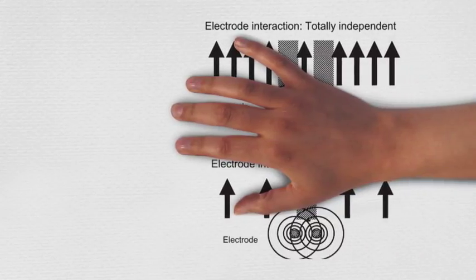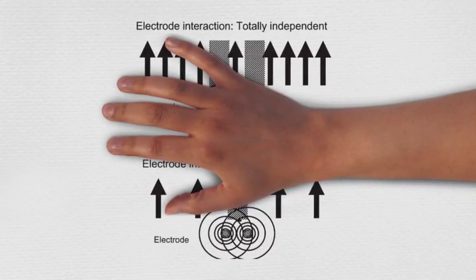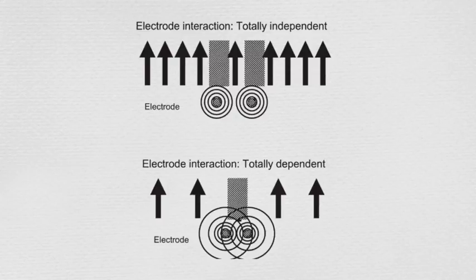A representative intracochlear array for cochlear implants. The white rings on the black carrier represent electrode contacts, which stimulate the auditory neurons in the modiolus.